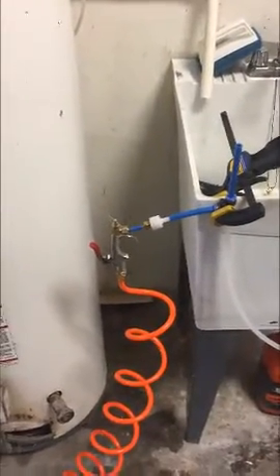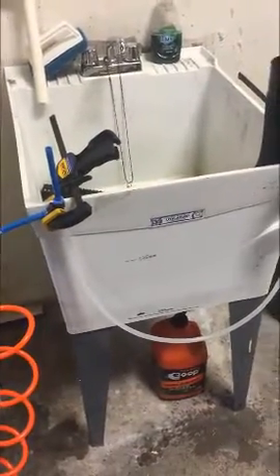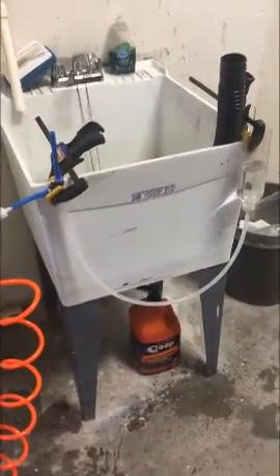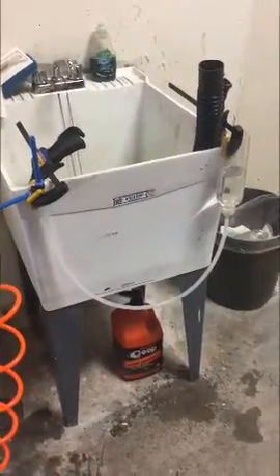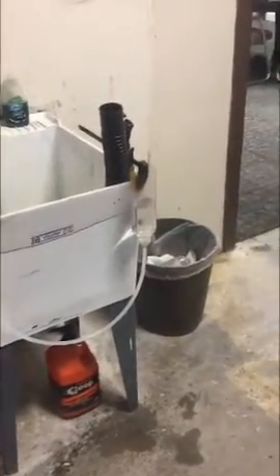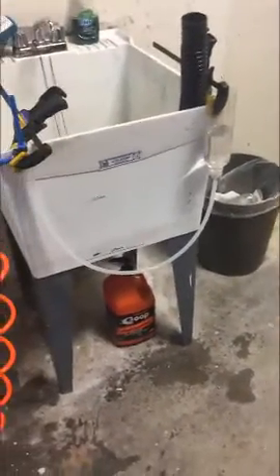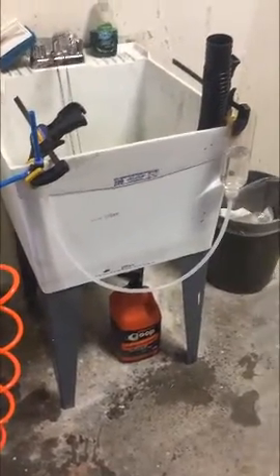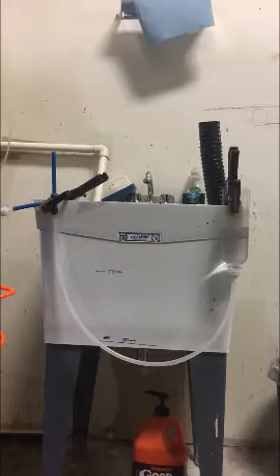So now if we automate this valve and make it a solenoid valve and put a timer on it, it will in fact pulse air into my lungs at a rate of 400 ml per breath at pressures that will follow whatever my resistance is, up to 40 centimeters of water. And obviously by mounting the bottle higher or less high, effectively varying the length of that tube, you can change what peak pressure you want it to get to before it won't go any higher, so you don't risk injuring the patient. Okay, so here you're going to see it in action.